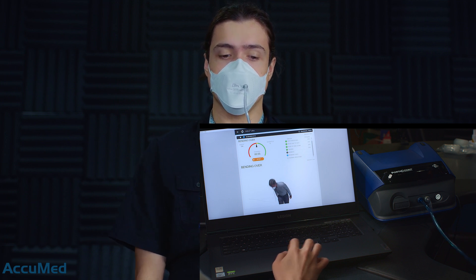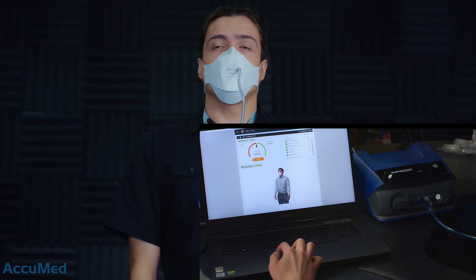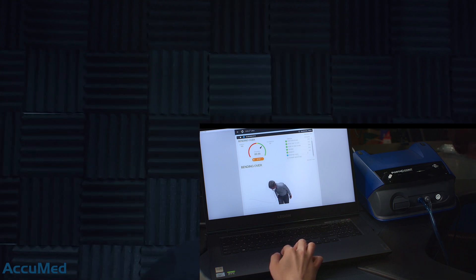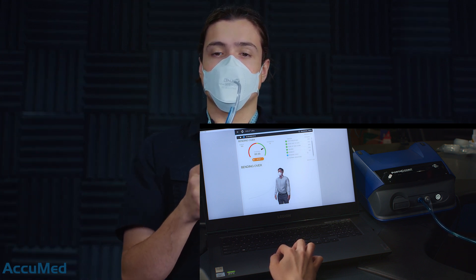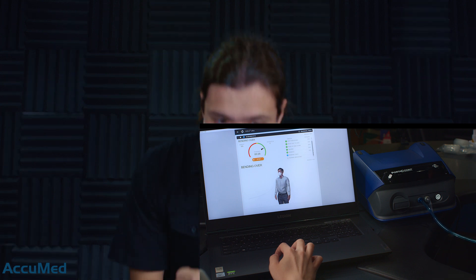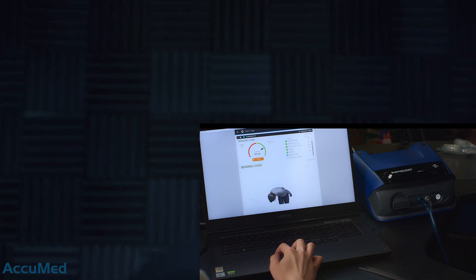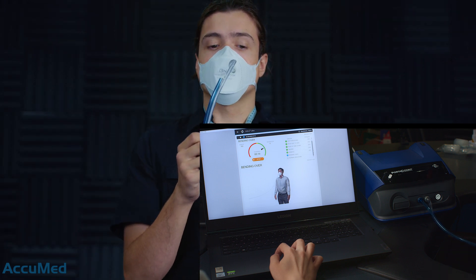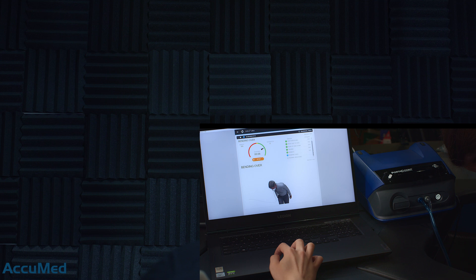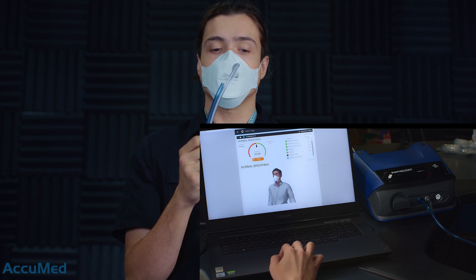Bending over — next exercise. Go down, up, down, up, down, up and down. All right, last exercise: normal breathing.